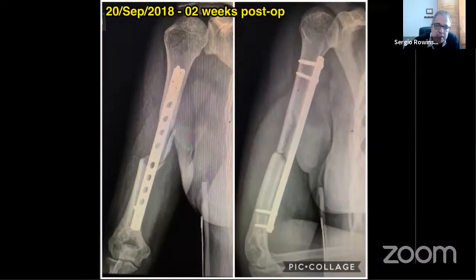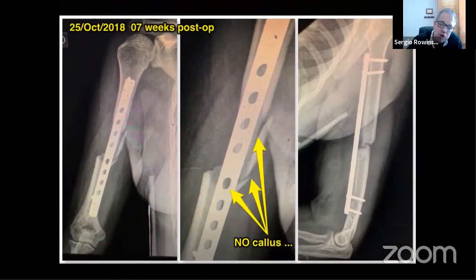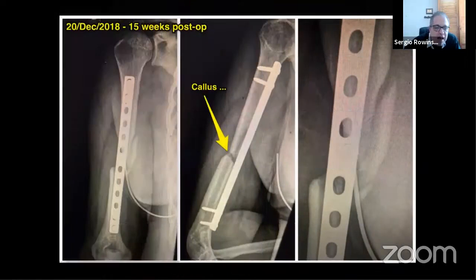Pay attention, everybody. 2 weeks, I see obviously nothing from a radiographical point of view. 7 weeks, the 21-year-old girl, a lot of bone; she's almost 70, her biological response is much smaller. So see here, 11 weeks, basically nothing, and some callus at 15 weeks, but you see on the right side, basically nothing on the AP view, and she's clinically healed. Clinical healing precedes radiographical healing.